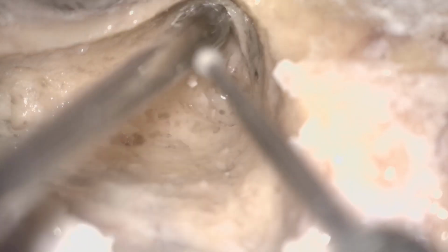The water is not flowing. Okay, fine. So you have to go very slowly up to the. Hello. Yes. Can you focus it more anteriorly, please? Yes, tell me.